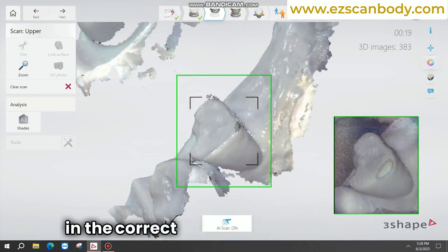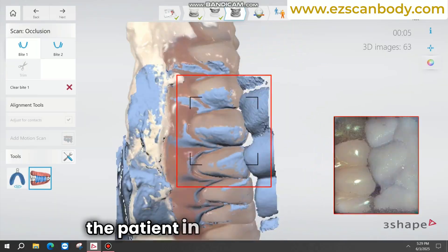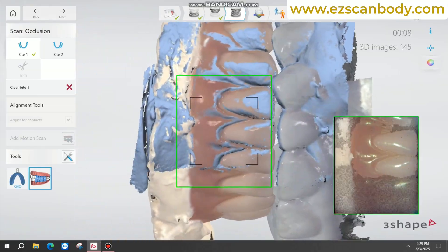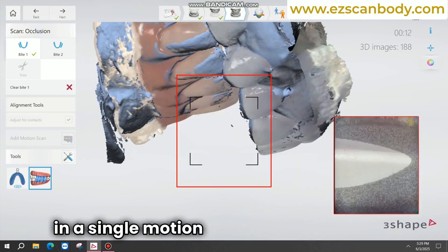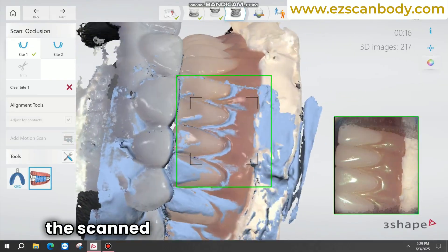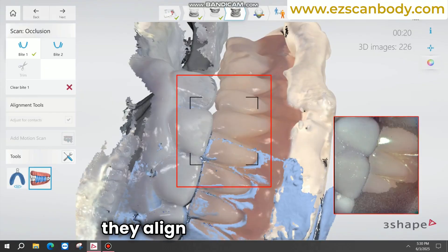Ensure the patient is in the correct biting position. If necessary, assist the patient in achieving the proper bite alignment. Ensure the bite is scanned in a single motion for accuracy. After scanning, check both the scanned bite and the position of the denture in the patient's mouth to confirm they align correctly.